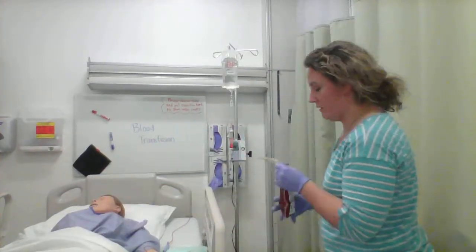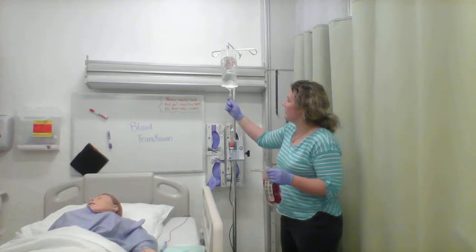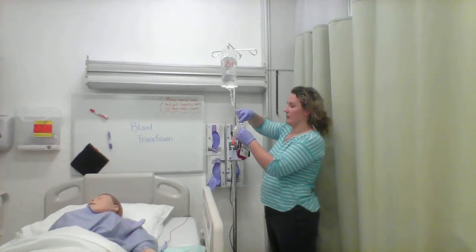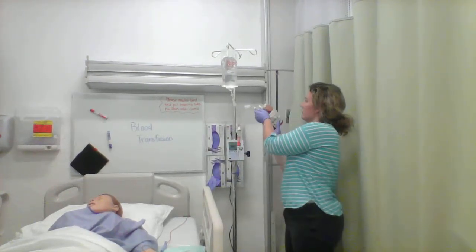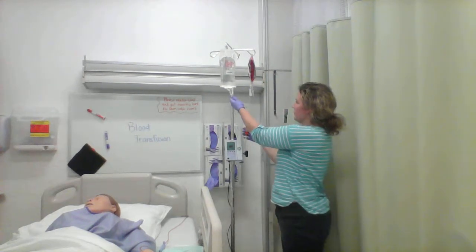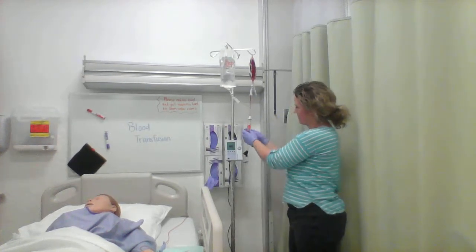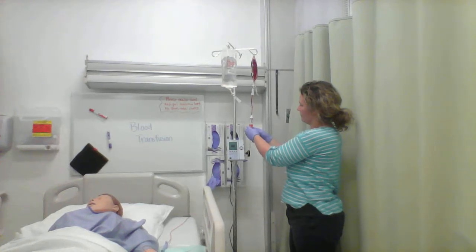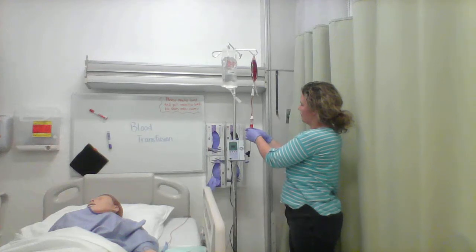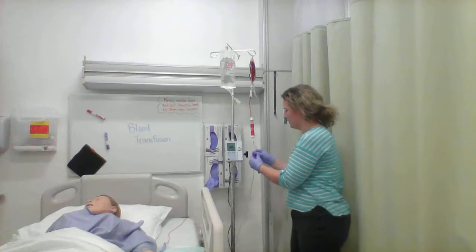Now we're approaching. So the IV line is open. We're going to go ahead and lock this up. And we're going to spike the red blood cell bag. Flip it. And then we're going to fill the chamber, opening up this one, keeping it in there. Okay, so the chamber is full.